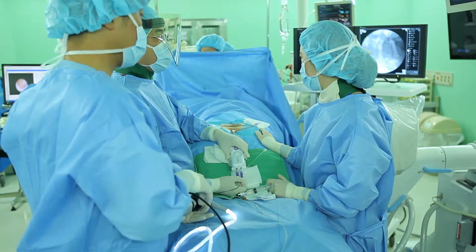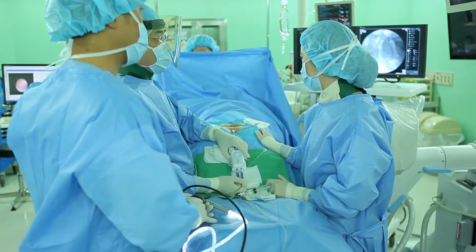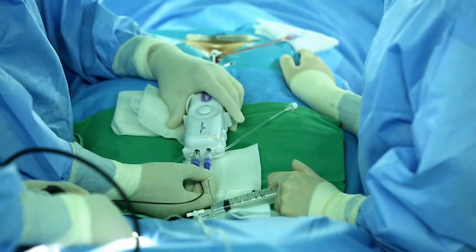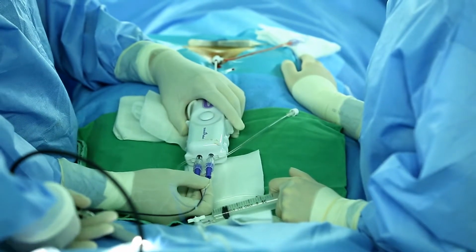Laser treatment is composed of stimulating or testing and shooting or firing. Explain stimulation first. The stimulation is required to make sure of firing the laser safely. Especially for the new doctor for SELD, safety is the most important point.